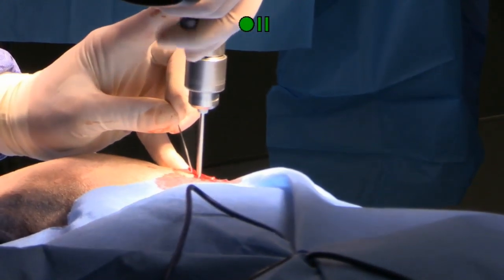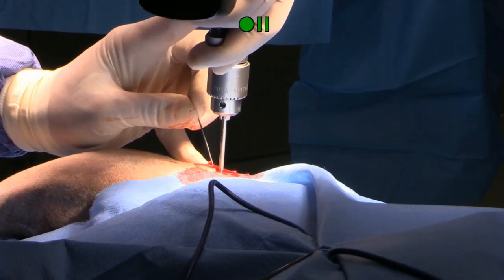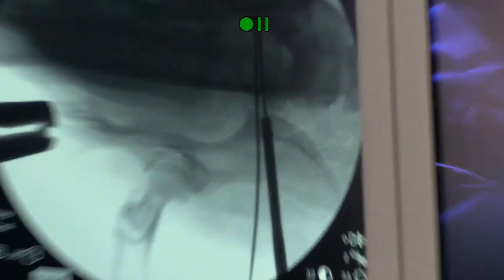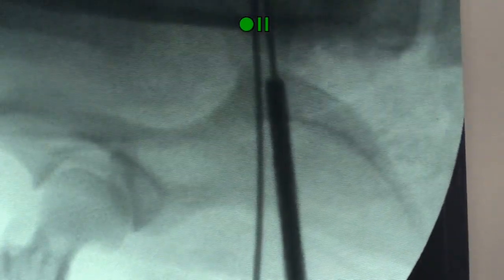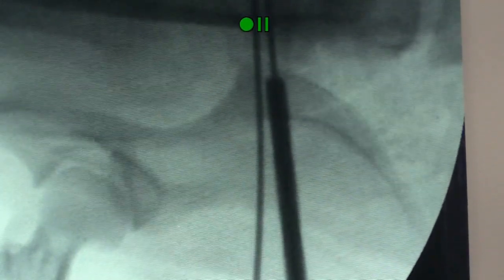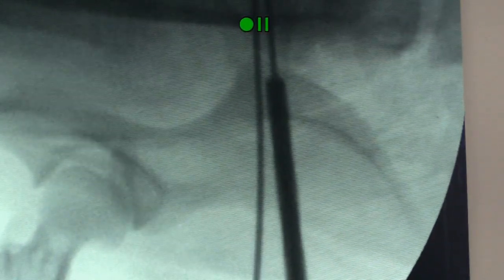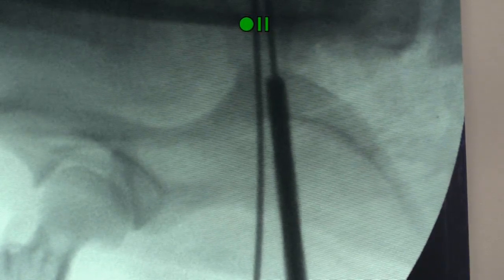So you just reinserted the pin manually, right? So we can see that he's advanced the 3.5 oversized drill bit, so it's just going through the medial cortex of the ilial wing, so that when we put screws in, they're going to engage the sacrum but not the ilial wing, so we'll be able to compress that together.